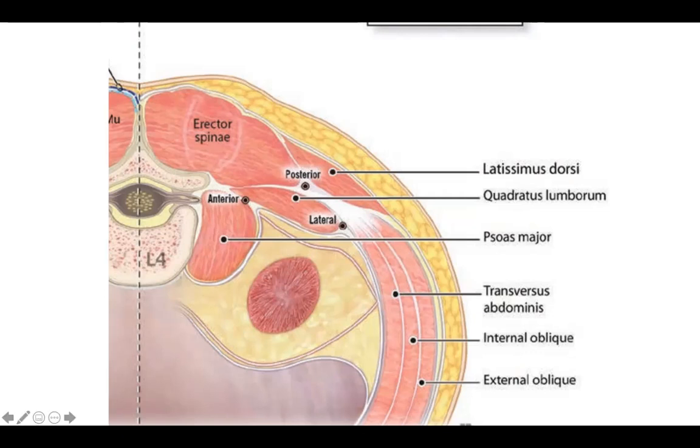When it comes to lateral QL, the efficacy is limited to the T12 and L1 area, so it is useful for elective C sections and open myomectomies.